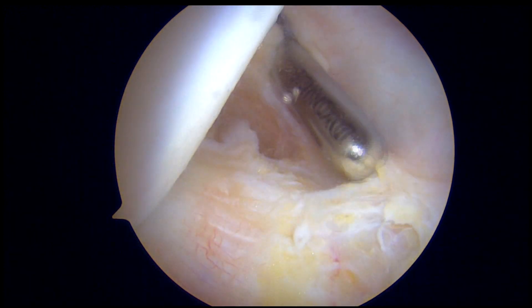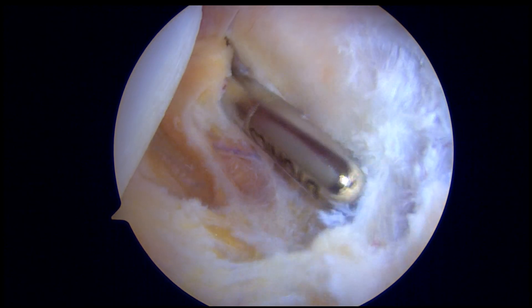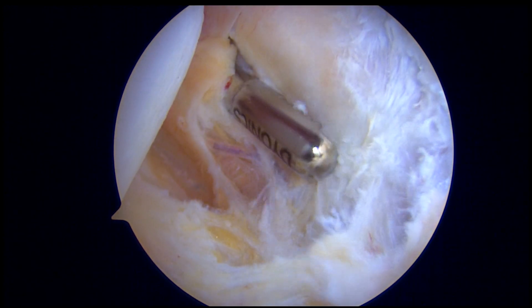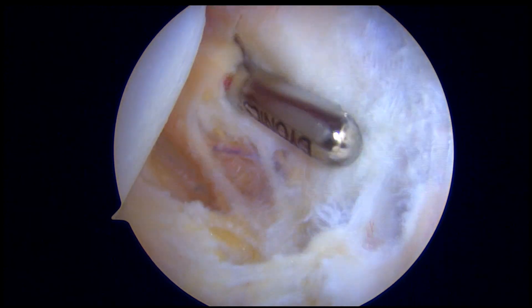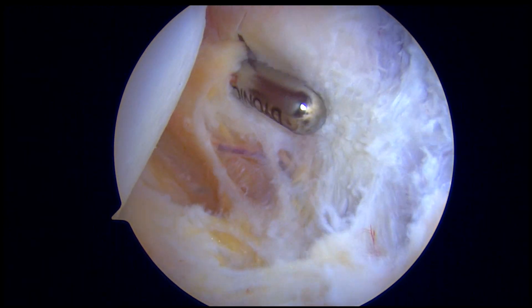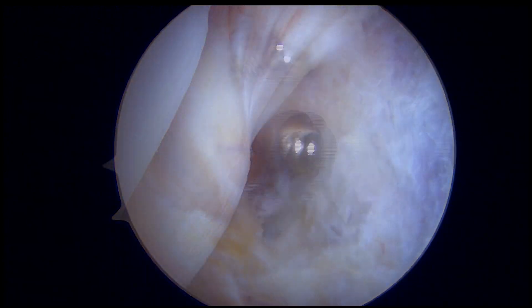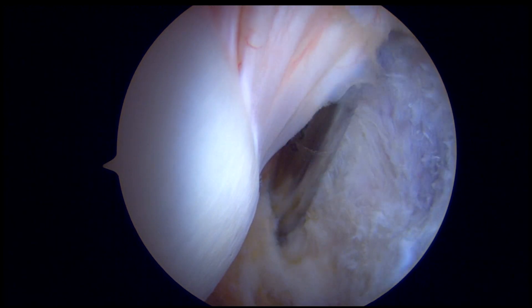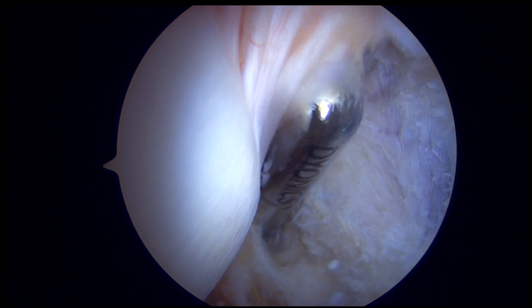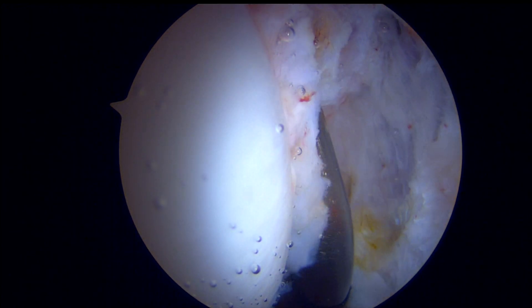We are now in the posterior lateral aspect of the knee, and the arthroscopic shaver is being utilized to perform this synovectomy and remove all of the synovial tissue and lining that otherwise produces these cartilaginous loose bodies. Here is the posterior portion of the femoral condyle, where we are being very aggressive by using the shaver as well as the ArthroCare device to ablate and remove the synovial tissue.